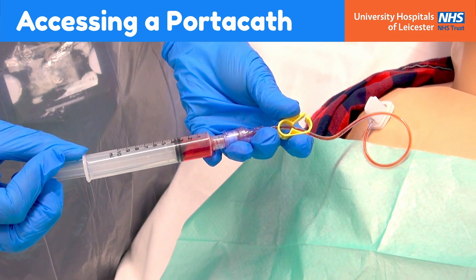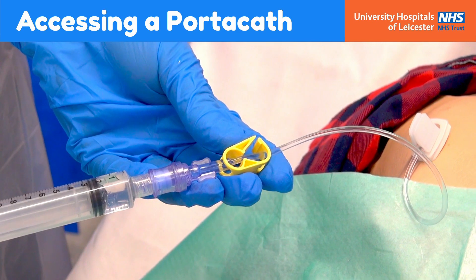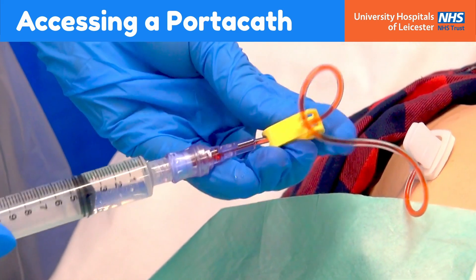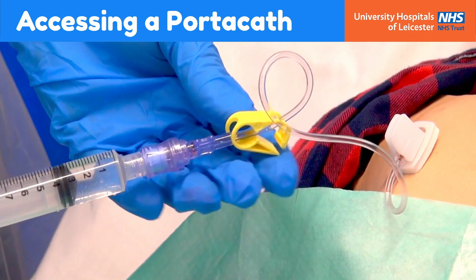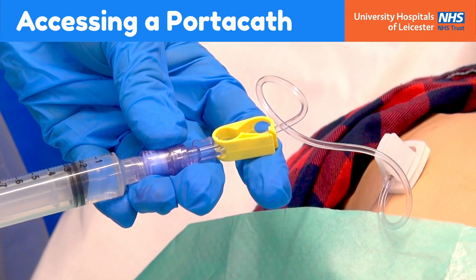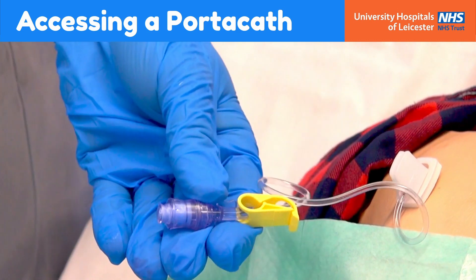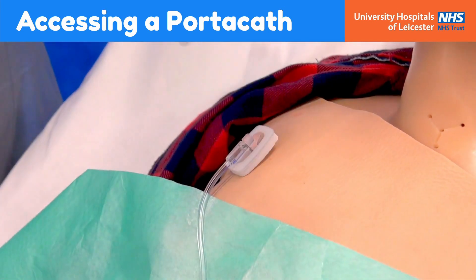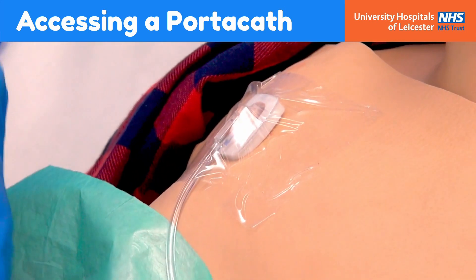The additional 10ml LuerLock syringes can be used for blood sampling. 5ml is taken in the first syringe and this can be used for culture or discarded. Flush the portacath with the remaining sodium chloride using the push-pause technique. Follow this with 4ml of heparin sodium 100 units/ml if the line is not being used immediately; this dose should be repeated after each future use. Ensure you clamp the tubing before each syringe change using the positive pressure technique. To secure the needle, remove the gripper needle plastic tab and cover with the transparent dressing. If removing, hold gauze over the area and apply a plaster once the bleeding has stopped.